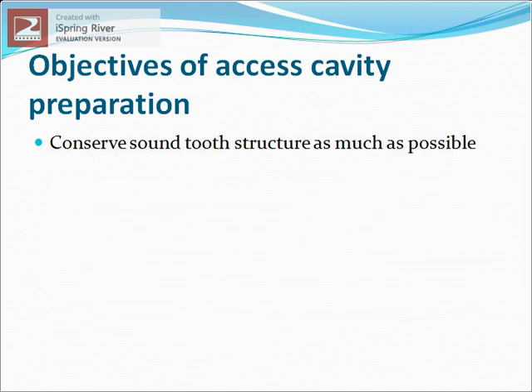Access cavity should be as conservative as possible, and this objective should be achieved in balance with the other objectives. Conservation of tooth structure should not be an excuse for not achieving the straight line access and complete deroofing.